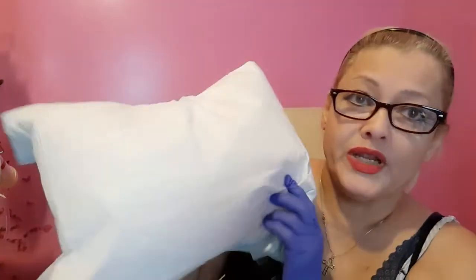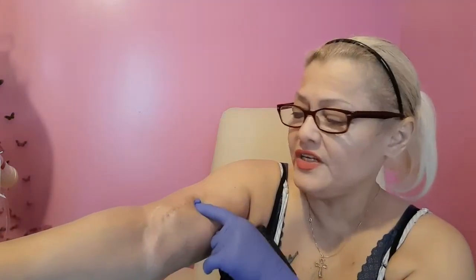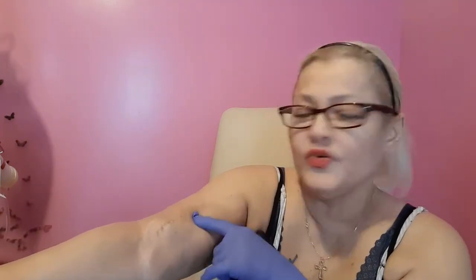All right, got my little pillow, and I taped a chuck over it to catch any excess blood that may drip. Let me tell you something about my lines. On this AV fistula, the arterial is at the bottom. Venous is always at the top. Arterial, Artie, as I like to call him, he's a gusher. Just look at him and he'll bleed. The venous is a bit more stubborn. She really doesn't like to be messed around with. So this is the one that always gives me the problems.